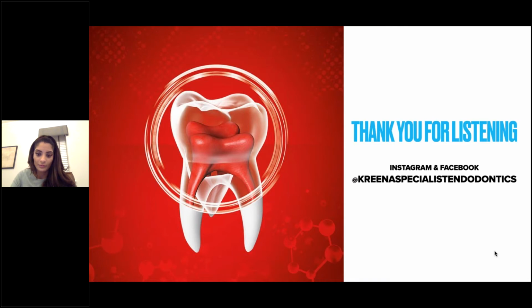What are your thoughts on treating an open apex? Is Biodentine easily placed at the apex? Yes, it's a very good use for Biodentine. Obviously, from when you mix the material to when it initially sets is 12 minutes, so you just have to make sure this is the time frame you have.